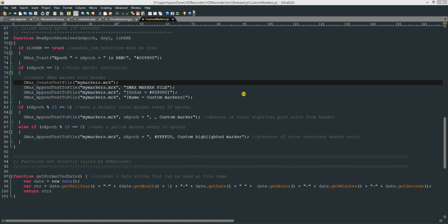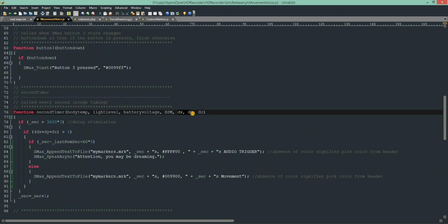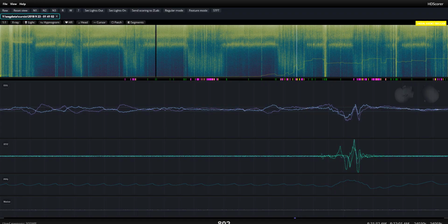Yesterday, I uploaded a video in which I presented a way to collect the movement information on a per second basis. And today, I went a little bit further and I incorporated that into a somewhat more robust algorithm that detects both the proximity to REM sleep as well as the movement. The way this is supposed to work, and I'm going to show you the results first.